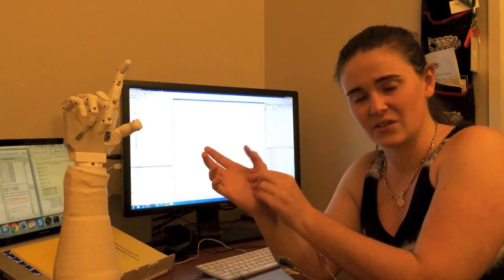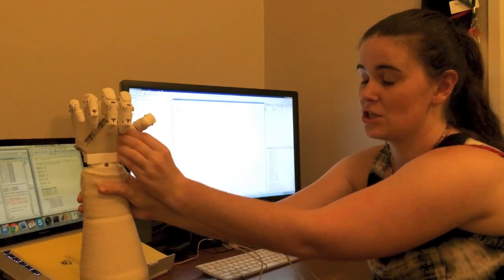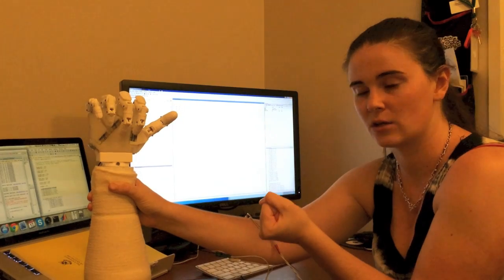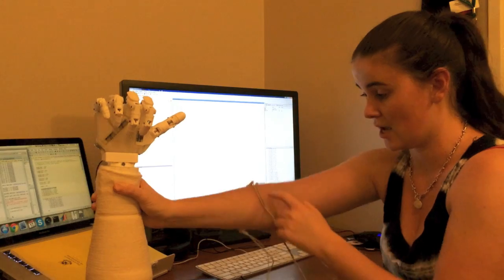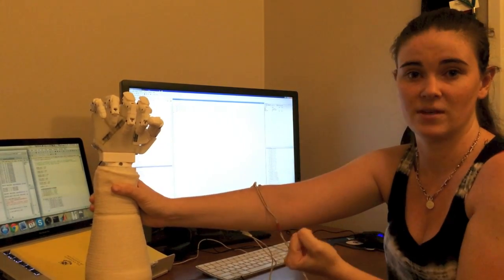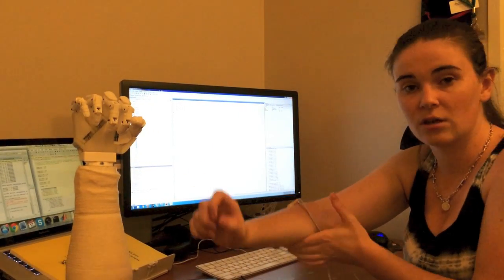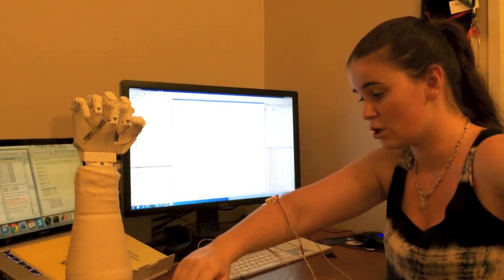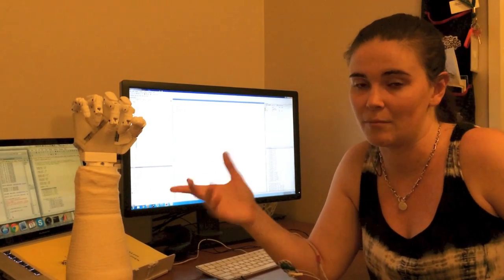The thumb acts like a switch in the commercially available products. The patient locks the thumb to a certain position, and that acts as an indication of how they want the hand to close. So if it's locked into this position, it means I want to make a point when you get activation from these muscles. But if it's locked into this position, I want you to make a fist instead. So by using the same muscles the commercially available prosthetics use, and by mapping different gesture patterns to activations in these muscles, I'm able to replicate the motions that are basically available.